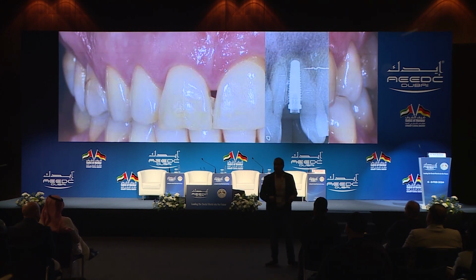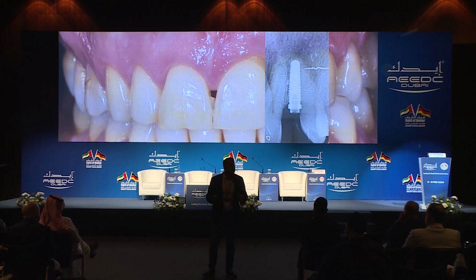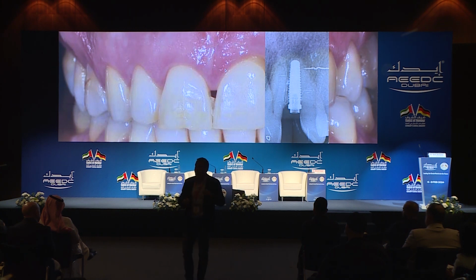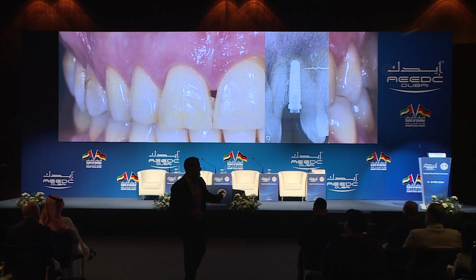This implant is really badly placed, too shallow. External connection. At the time, when you use an external connection, the connection between the implant and the abutment has a gap. And you always have, with these types of implants, some bone loss. You always have this saucerization effect. Plus, the bone is not lost just on the implant, you lose bone on the adjacent teeth. So the issue now is not just the implant, but the central and the canine.